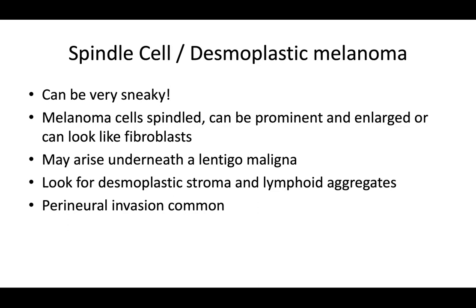So if you do a PRAME stain and it's diffusely positive, I would say that should increase your suspicion that you are dealing with a desmoplastic melanoma. Of course, with these, you're not going to make the diagnosis by yourself because you're going to need to show it to other pathologists as well, just to get a consensus before you sign out something like this. But have a high degree of suspicion, especially on the head and neck of sun damaged patients.